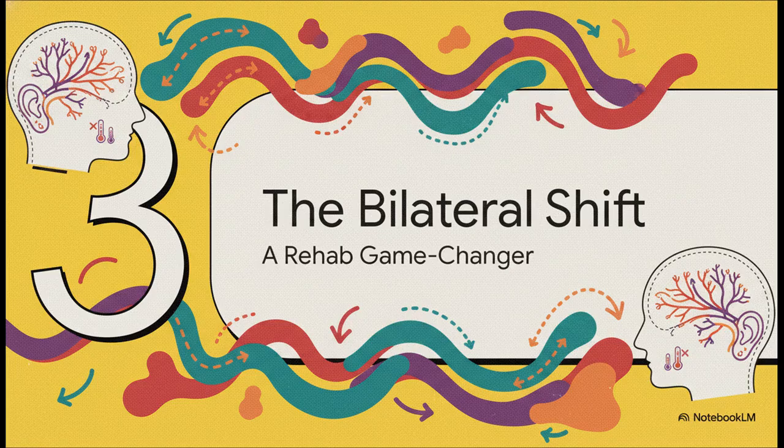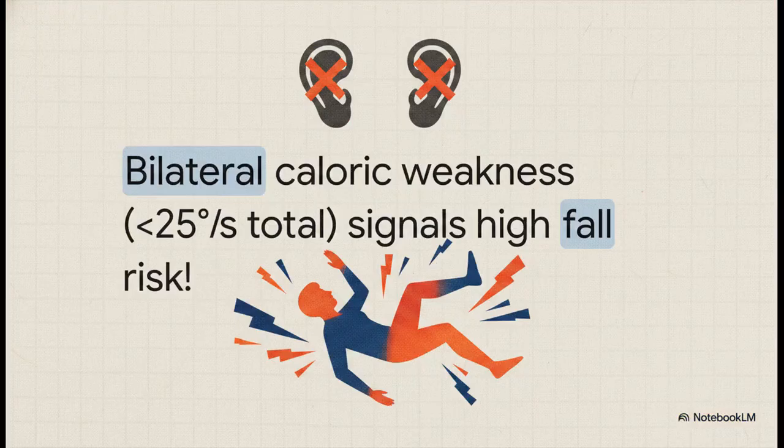Section 3. The bilateral shift. But what if the weakness isn't just on one side? What if both canals are failing the caloric test? If you're looking at the report and the total caloric response is under 25 degrees per second across both ears combined, you are officially dealing with bilateral vestibulopathy.